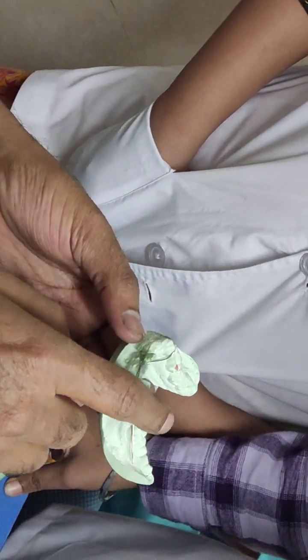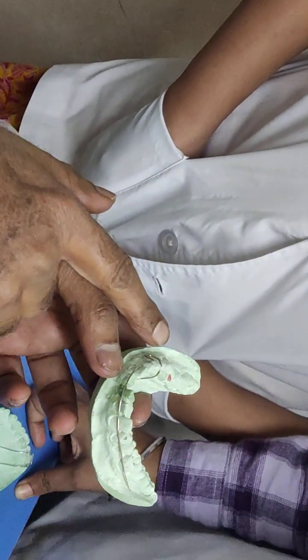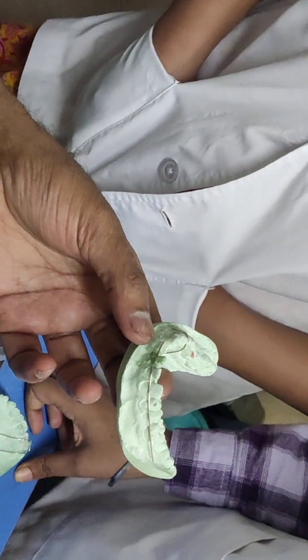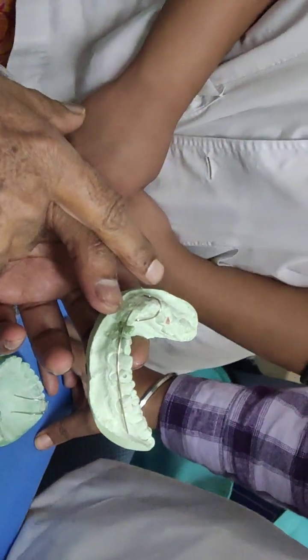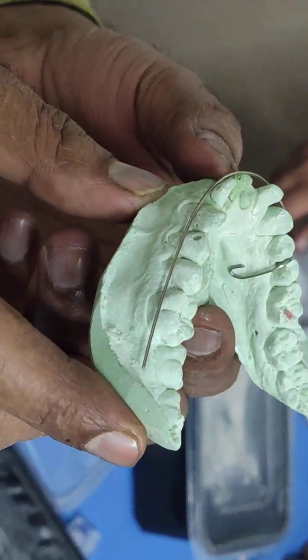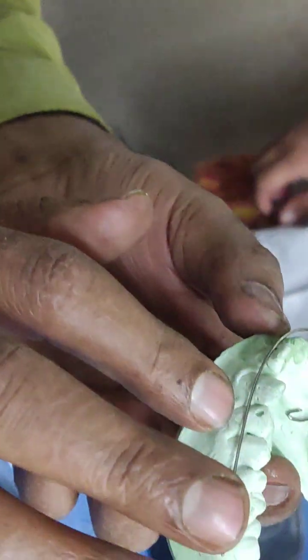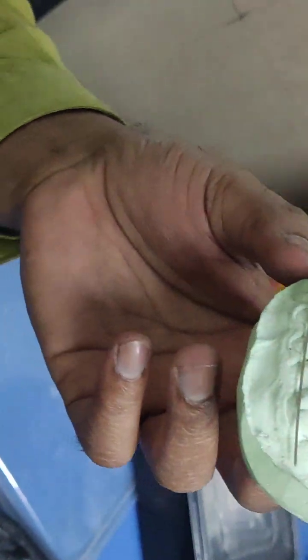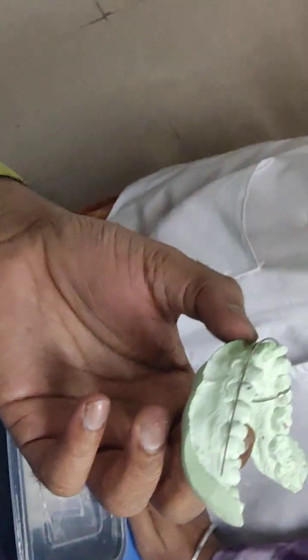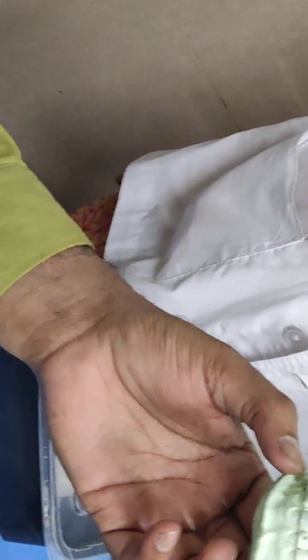The problem is this side, left side premolars are relatively elevated compared to right side. Okay, this is the patient's right side. They are not on the same plane. That is why, if it is up, obviously the wire, in spite of being on the same plane, looks like it is placed downward. So don't change the plane.